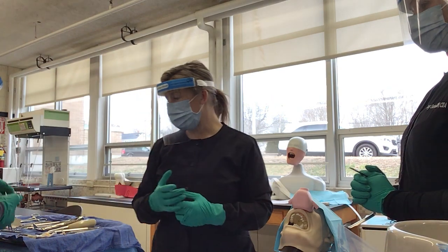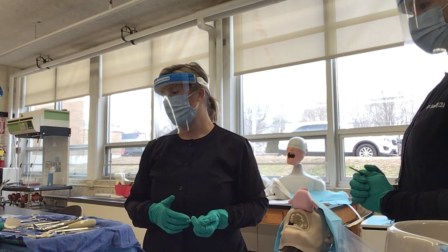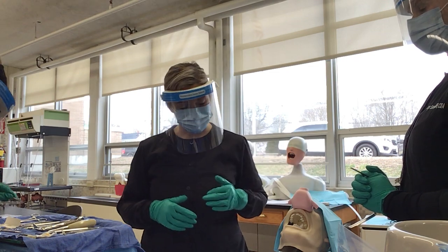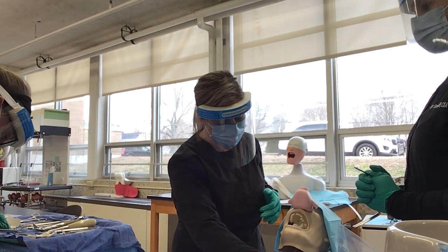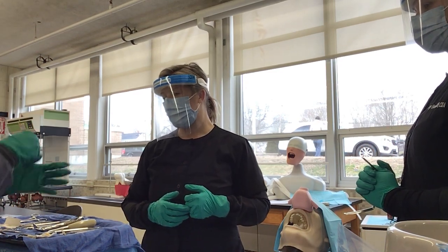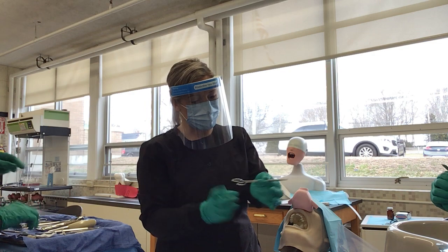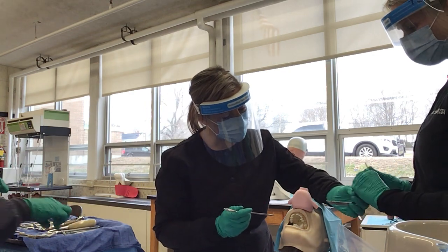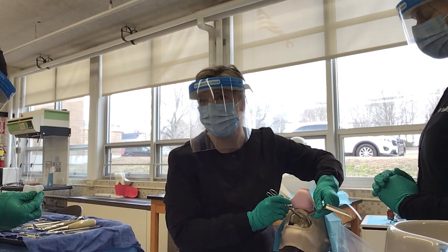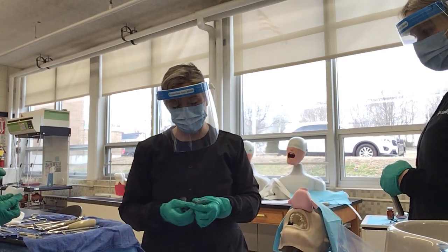So Mrs. Yeomans is loading up a silk suture. So is it resorbable or non-resorbable? Non-resorbable. And she's gonna load that so we can suture on the maxillary left, buccal to lingual, okay? Thank you. So she passes it, holding the suture on the left, and then I would steal this retractor, and we would go in and retract, and I would start suturing buccal to lingual, okay? We don't want to pierce and chew up this tissue, so we're going to do the suturing here.